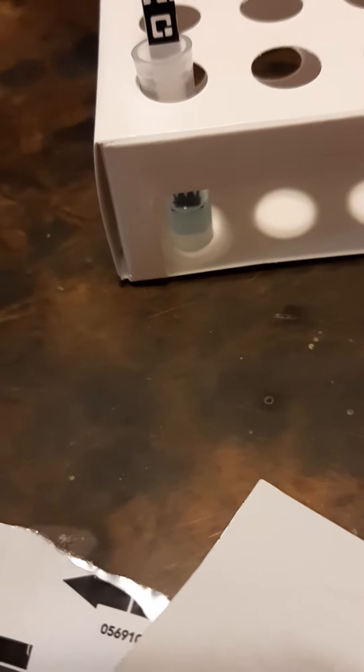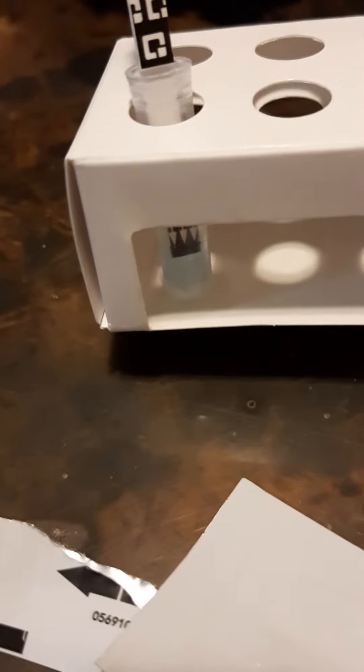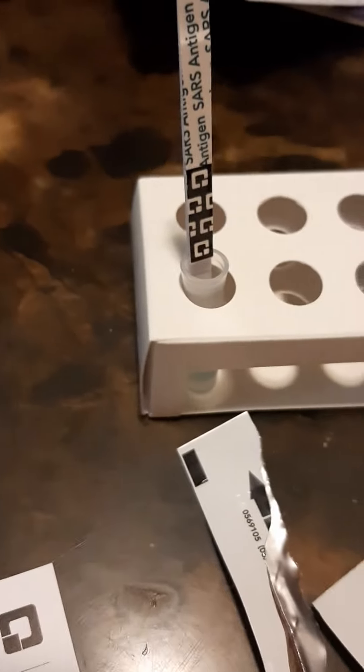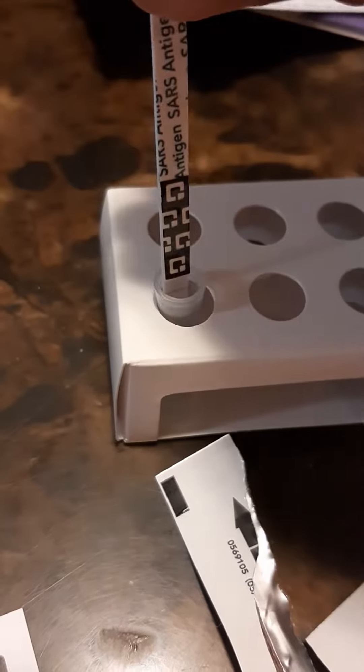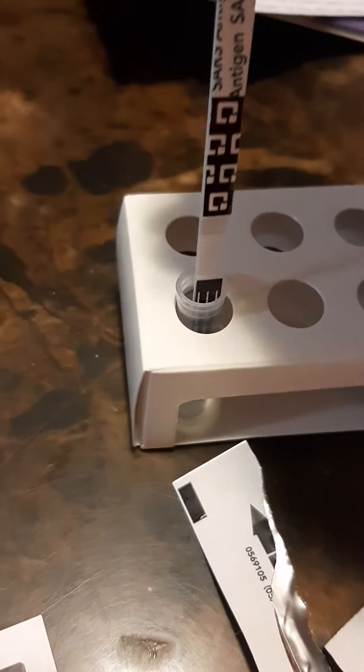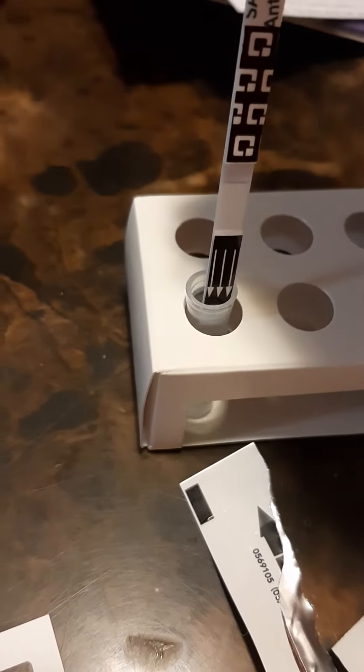For ten minutes with the arrow point down. All right, 10 minutes later.